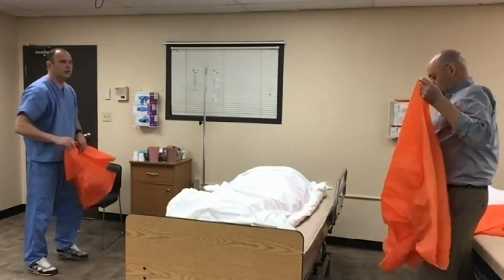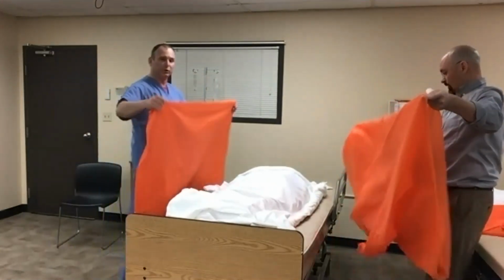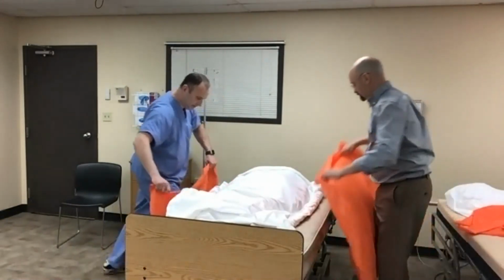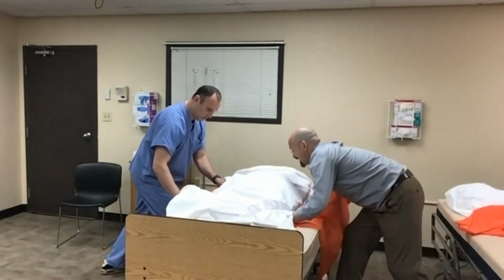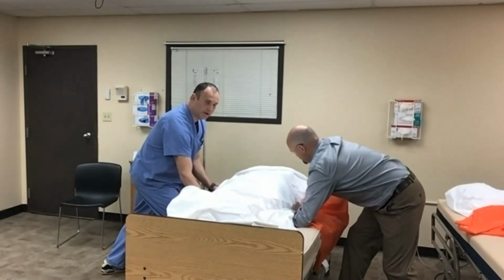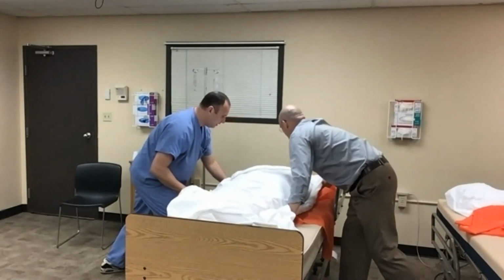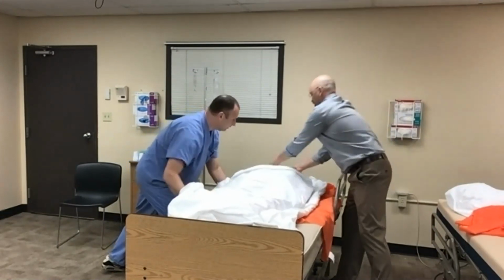So we're going to not use the bariatric one. We're going to use the 2 smaller ones tucked on each side. Again, this is just tucking underneath. So you're not rolling like you're changing linen. You're literally just taking it and tucking it underneath. That's all you have to do. Tuck, tuck, tuck, tuck.